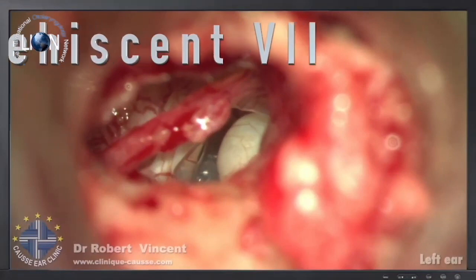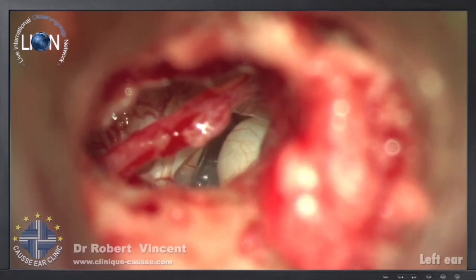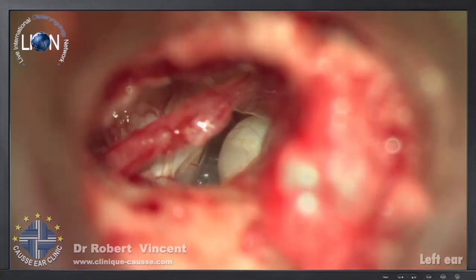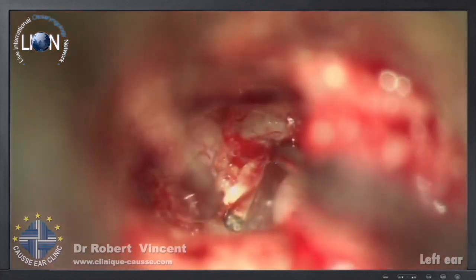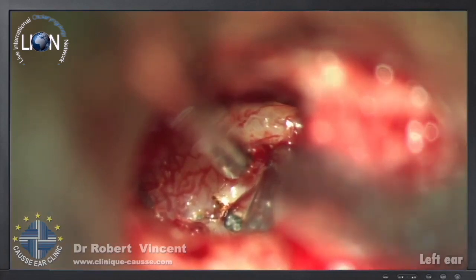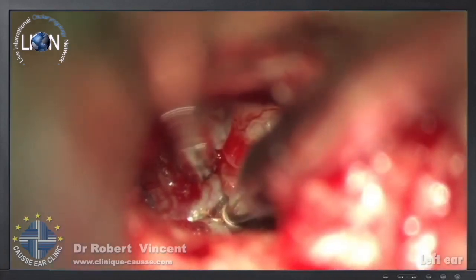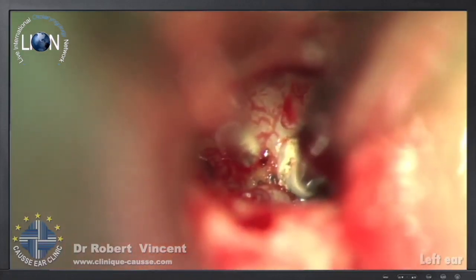Now, the case of a dehiscent facial nerve like this, in this case, there's a very small gap, but once we remove the superstructure, we will get a better gap. So you see the facial nerve is completely uncovered by bone. So I will remove first the superstructure. In that case, of course, having a laser with a handpiece rather than micro-manipulating is really a very nice tool.